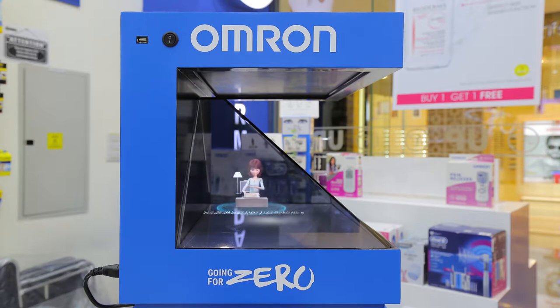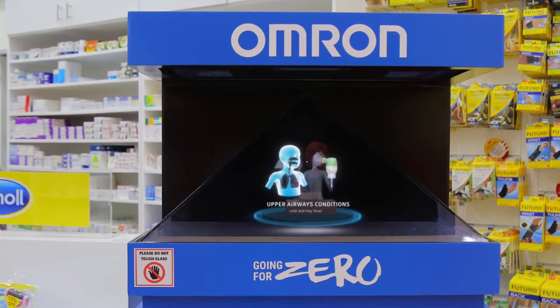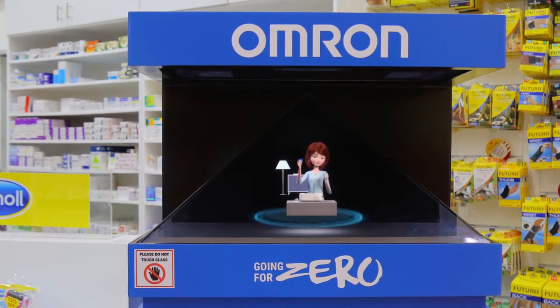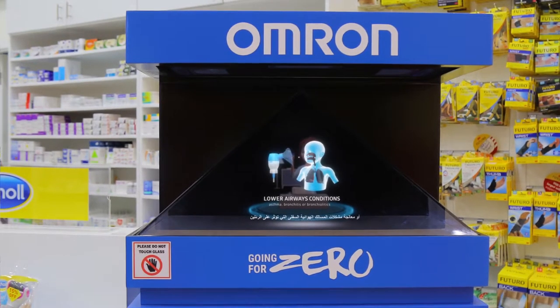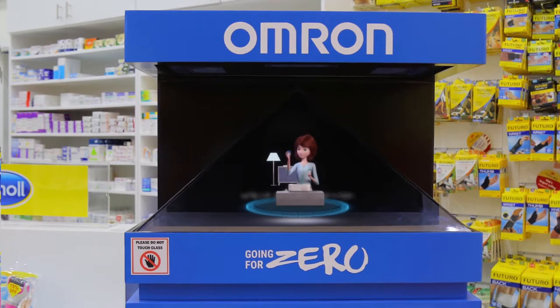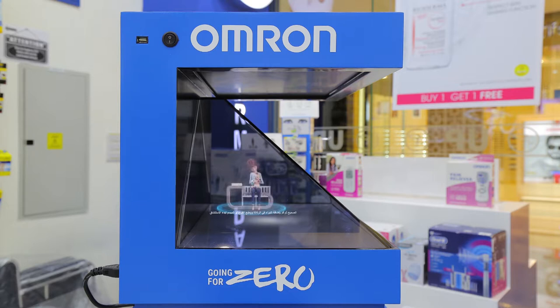After using the aspirator, you can then continue with the nebulization. With two exchangeable parts, it can be used to treat upper airways conditions affecting the nose or throat, or lower airways conditions affecting the lungs. To use it, simply select the right inhalation top, add the medication in the nebulizer kit, and place the mask or mouthpiece to start the inhalation.